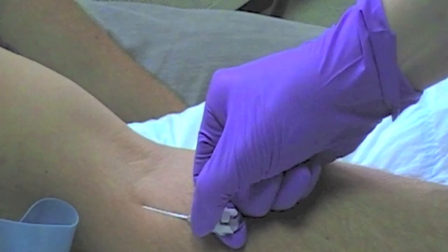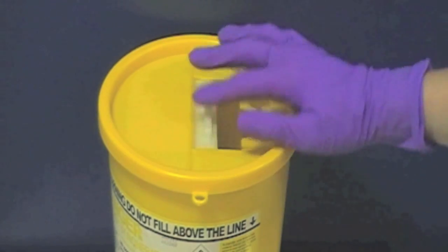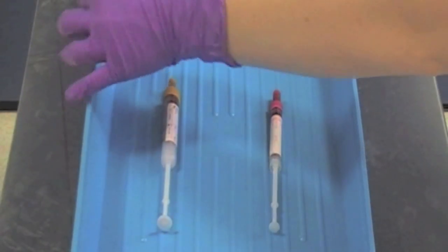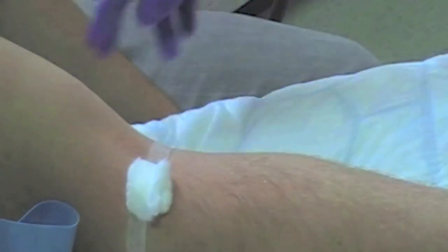Without pressure, apply the cotton wool swab to the puncture site. Withdraw the needle and put it immediately into the sharps bin. Now apply pressure directly over the puncture site. Use a piece of tape to secure the dressing.